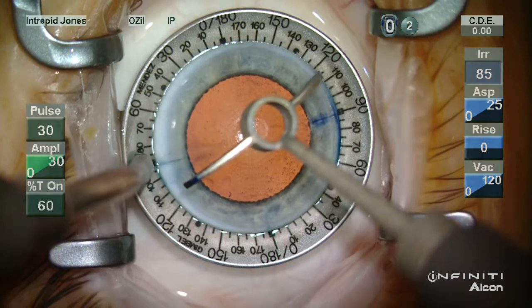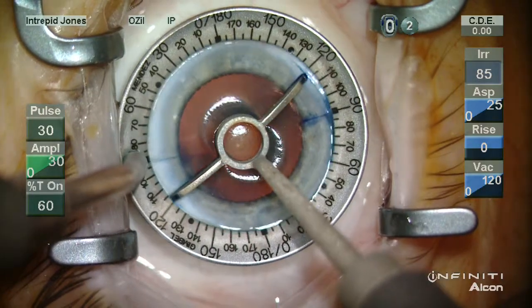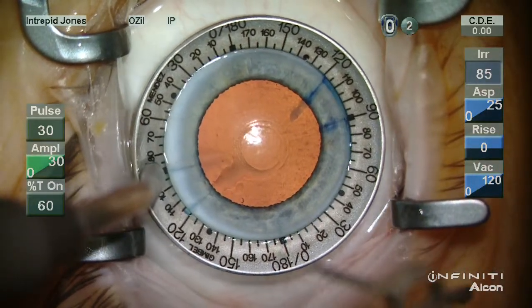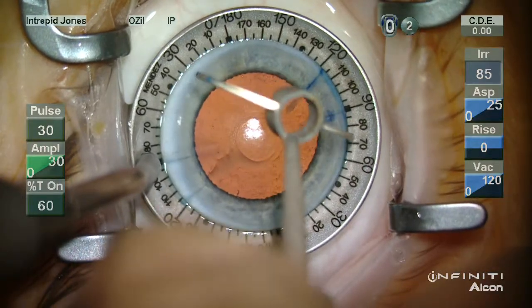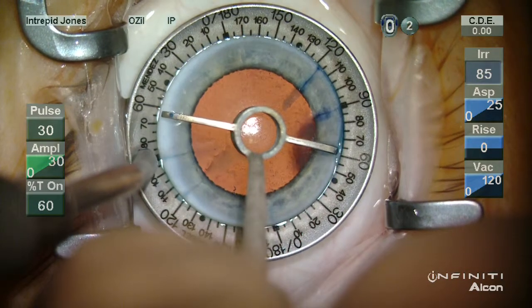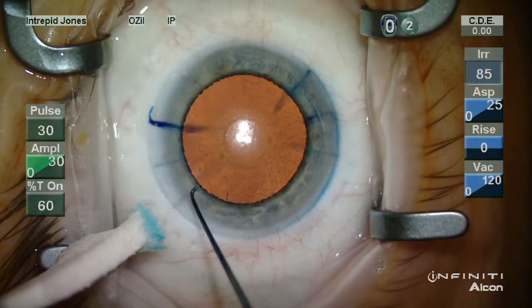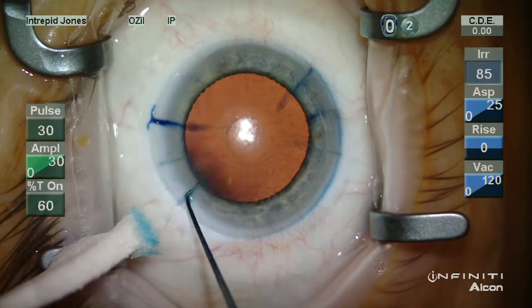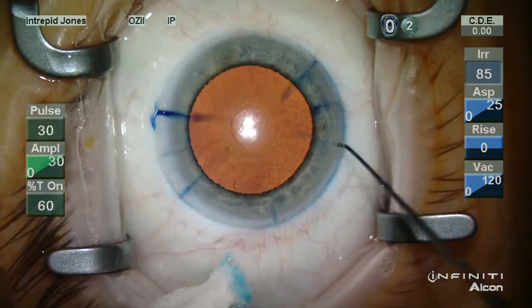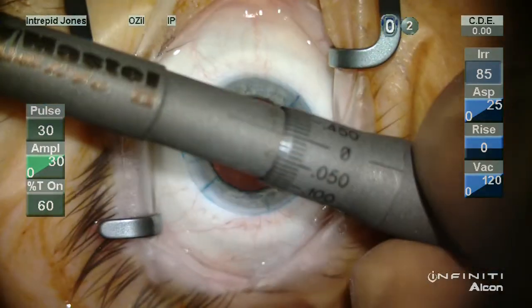The ring is then rotated, and we're going to do a 55-degree arc, touching down on one side and then to the other. And once again, placing a similar mark here. Now it's very helpful to look for symmetry of your marks to ensure that you actually have marked off all of these accurately. I will often touch up these marks with additional methylene blue using a Sinskey hook. The methylene blue is obtained from Hurricane Medical, and this gives a long-lasting effect, certainly adequate for these procedures.